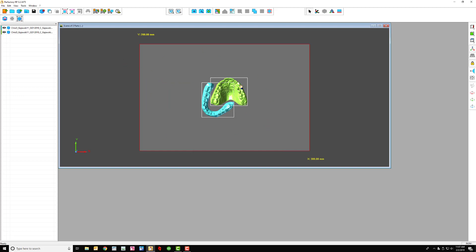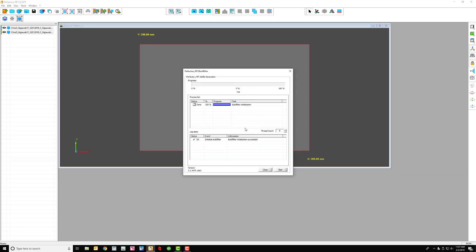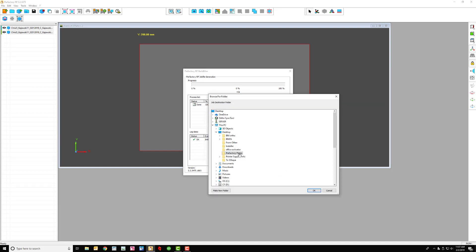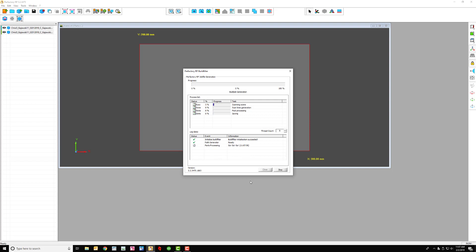I already have these selected, so I would just go into build. Not all parts have supports. I never have supports. Yes. And then it's going to bring up the building program. And I'm going to hit start. It's going to go right into the prefactory plates. Okay. And I just want to start now. I only have two models so this should be fairly quick. The more models that you have, this will take a lot longer.